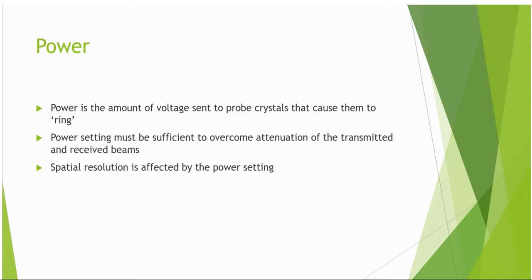Increasing the power increases the amount of ultrasound dose given to the patient. This is important in relation to undesirable bioeffects such as cavitation and heating. The different imaging modalities will have varying levels of acceptance, such as cardiac has low risk of cavitation effects, and blood moving through the structures means that heating effects are reasonably low. The tolerance for obstetrics is far lower to be safer for the child. Also be aware that the imaging setting we're in will also have a significant effect, in that pulse wave Doppler gives a much larger dose of specific ultrasound in an area compared to 2D imaging.